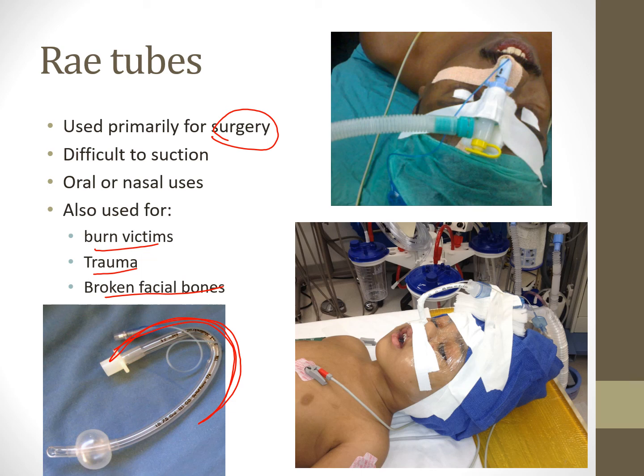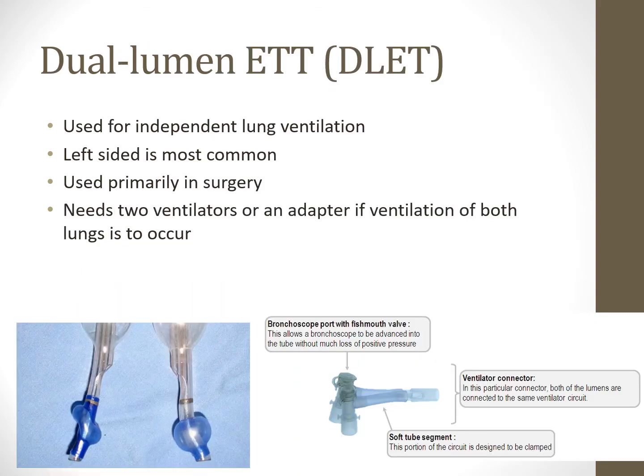overall. So you can either put it through the nose like you see with this little kid here, or you can go oral like you see up here with that patient. So it can go through the nose or through the oral pharynx. And it can be very helpful for patients that need a jaw surgery or things like that.